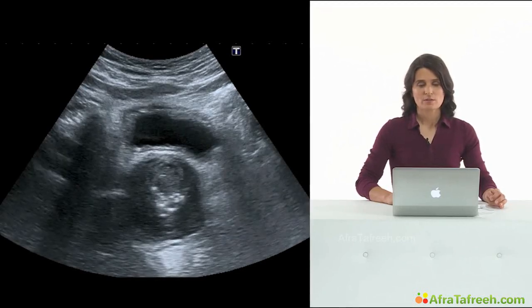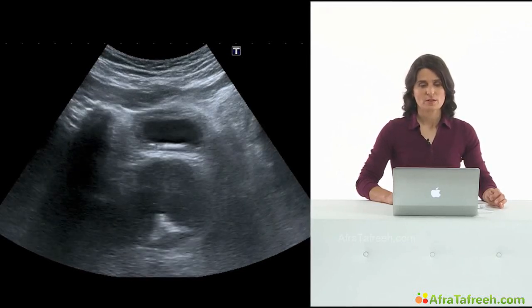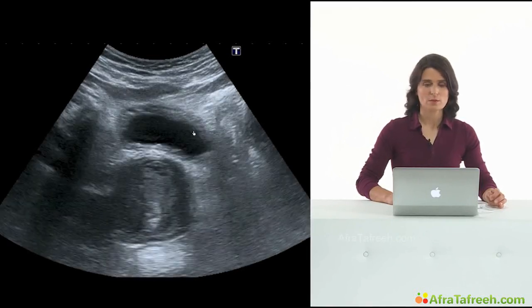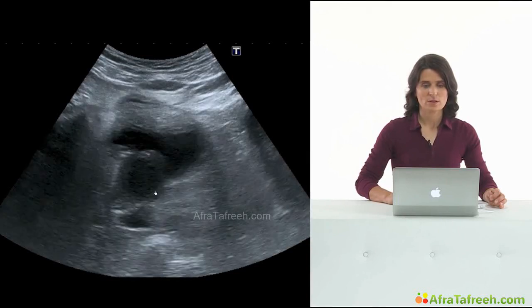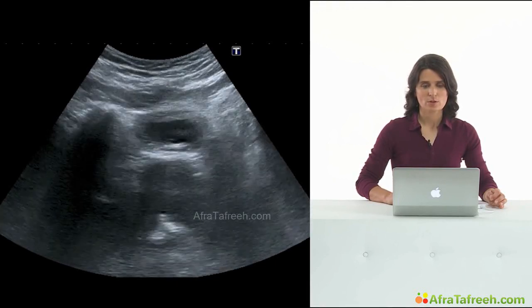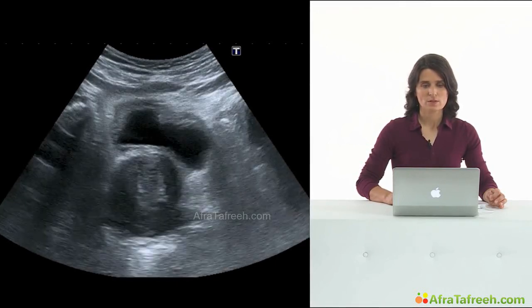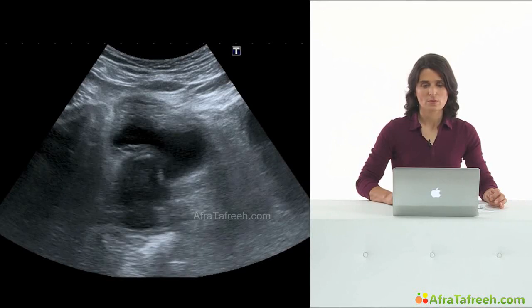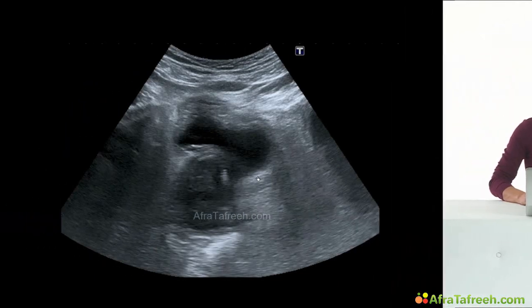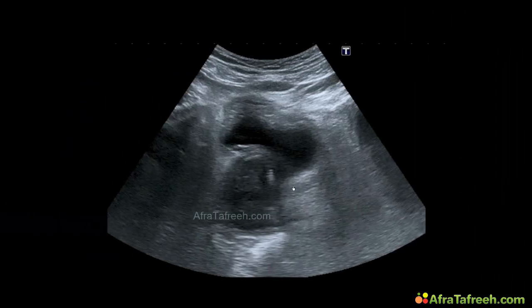Here's the same patient, now this time his prostate in a transverse scan. When I stop the video over here, we can easily see the urinary bladder and this enlarged prostate, inhomogeneous, over here, calcifications, and I want to show you this feature at the end of our video. So the bladder wall is not clearly distinguishable anymore. So this is highly suspicious for a prostatic carcinoma.